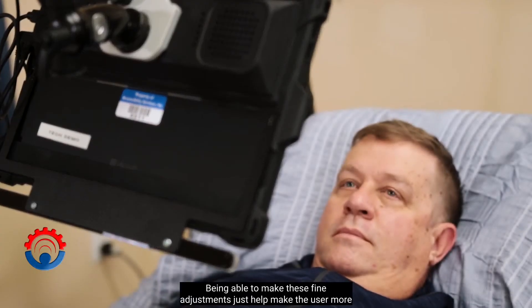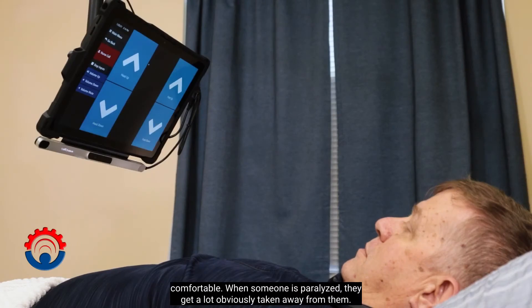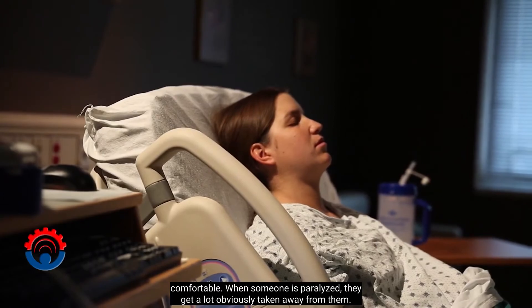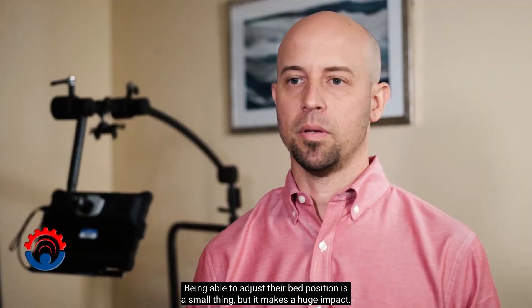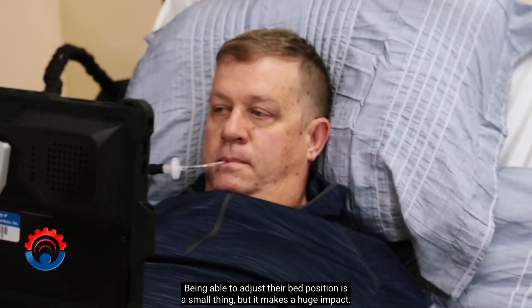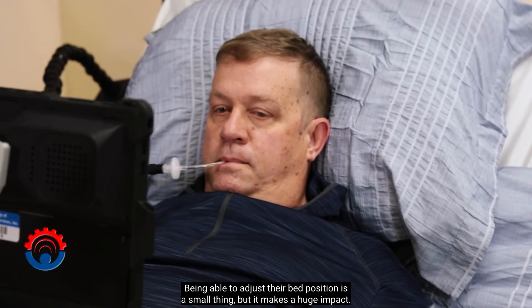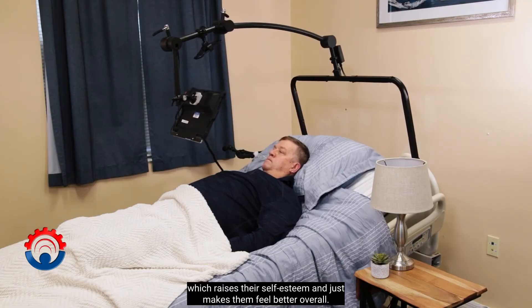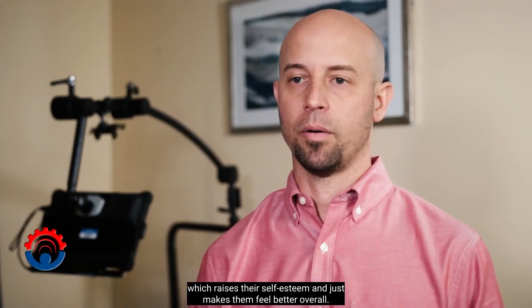Being able to make these fine adjustments helps make the user more comfortable. When someone's paralyzed, they get a lot obviously taken away from them. Being able to adjust their bed position is a small thing, but it makes a huge impact. It gives them a sense of empowerment, which raises their self-esteem and just makes them feel better overall.